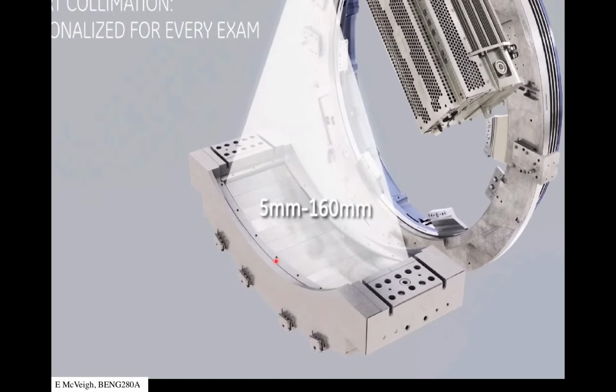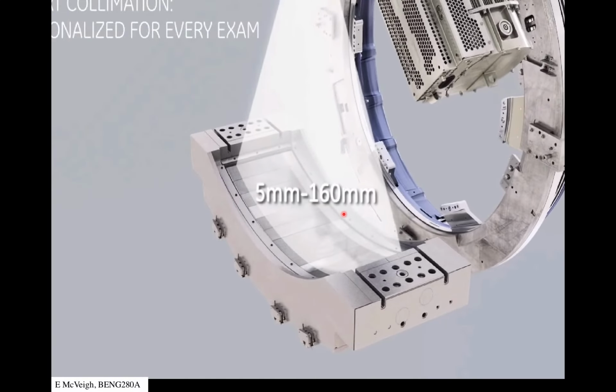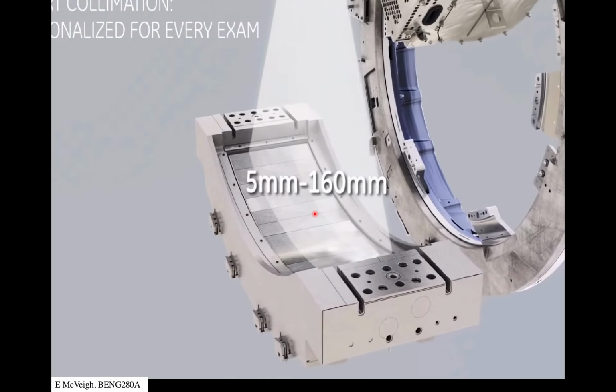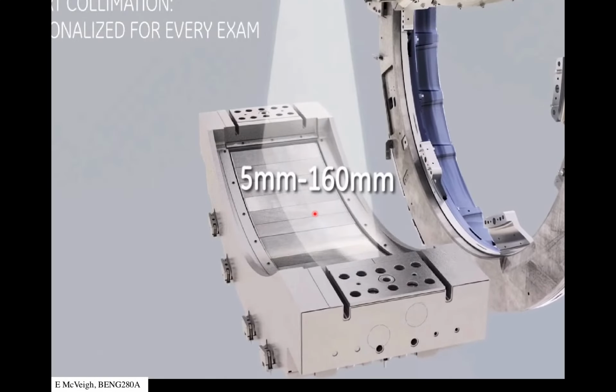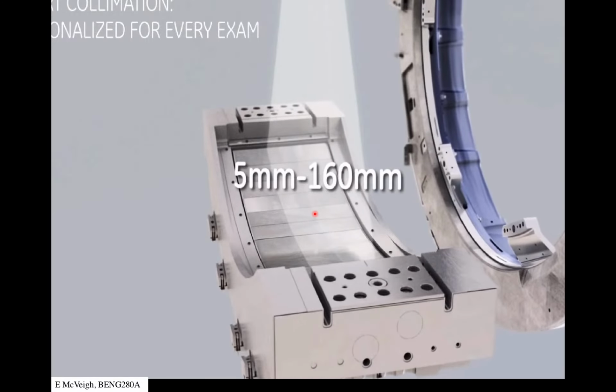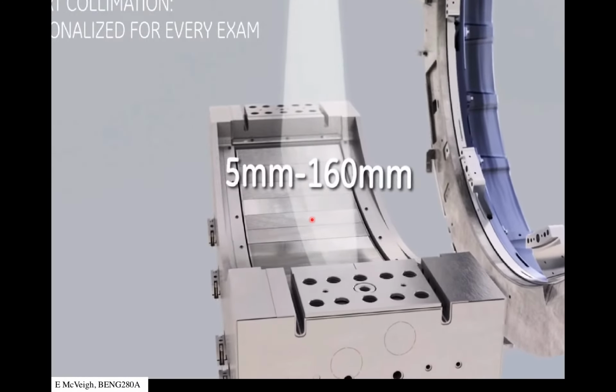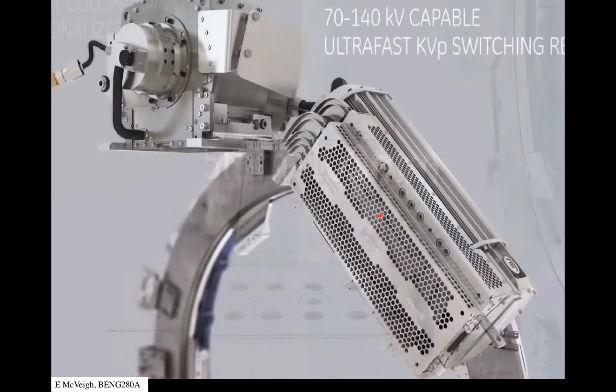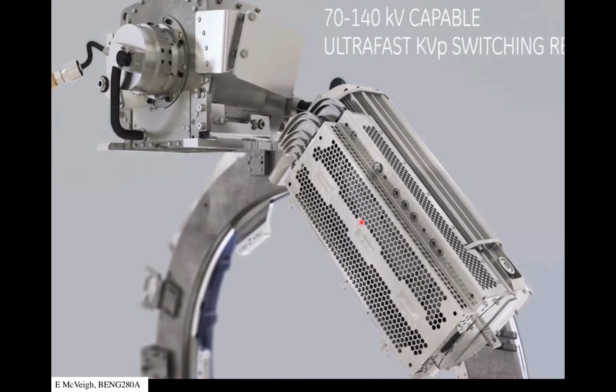So here's the detector in Z, 1000 this way, 256 this way. Using a shutter system at the top of the source, you can narrow down your field of view to smaller than the full 160 millimeter field of view. And there's the voltage source and the X-ray tube itself.